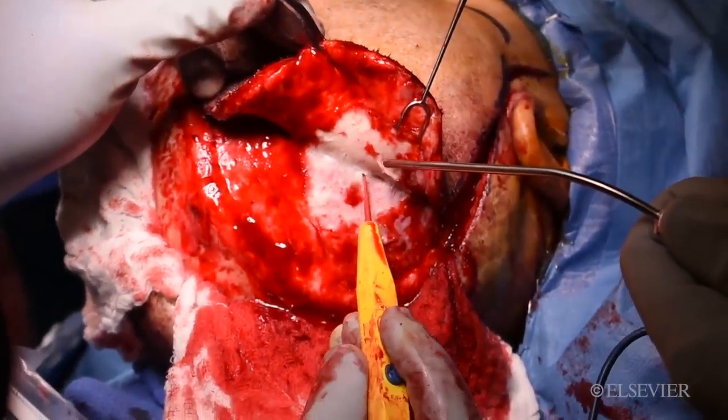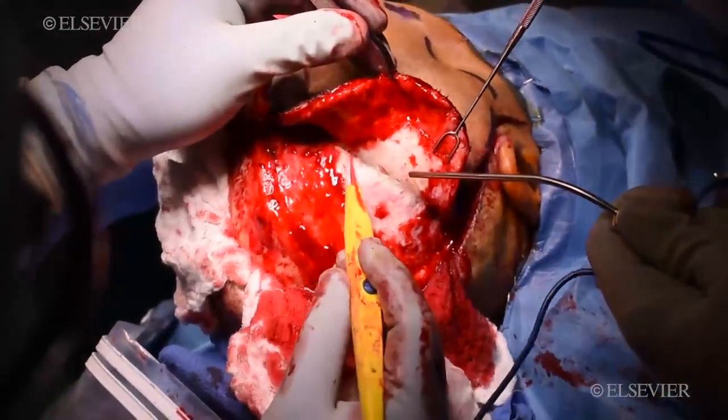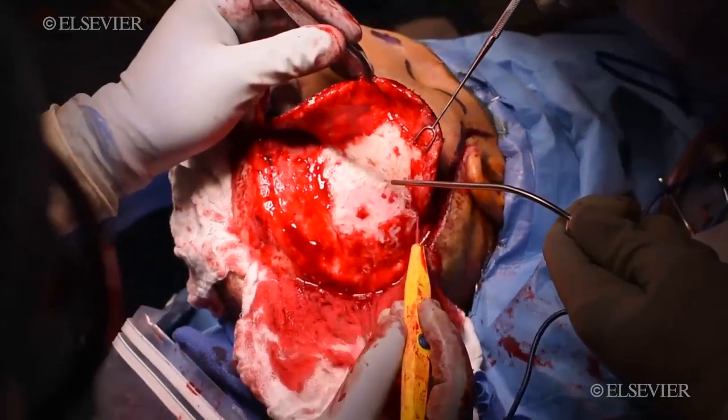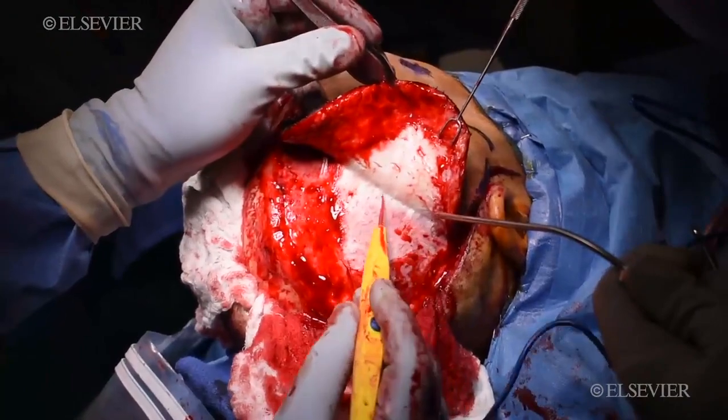As the flap is elevated, we're careful to keep the galea aponeurosis intact above to protect the subdermal plexus. The vascularized pericranium is left intact, protecting the epidural space.